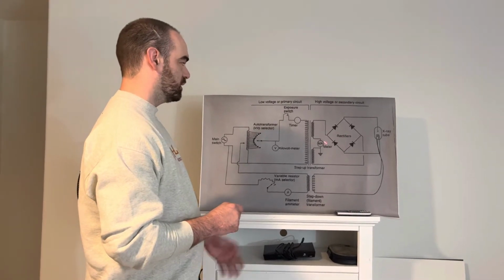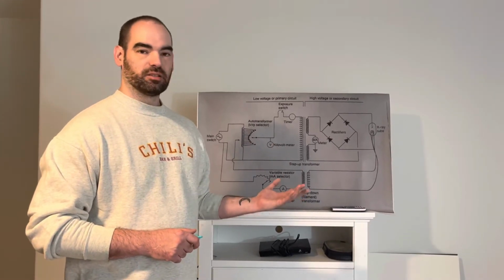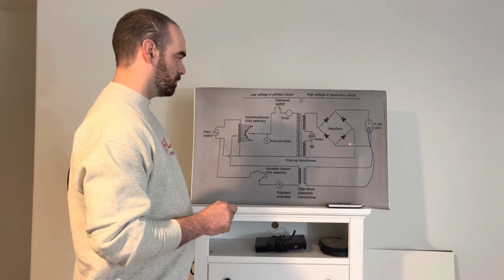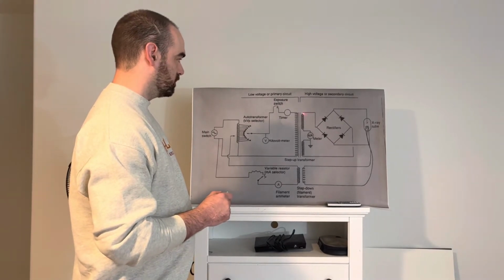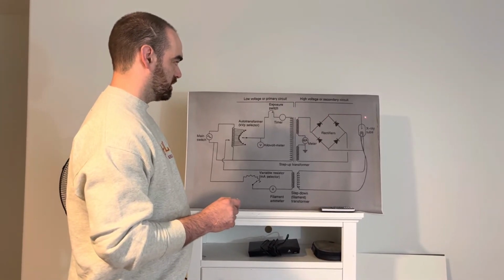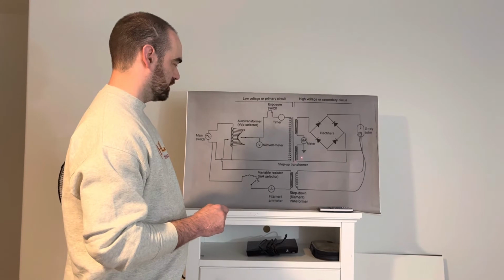Now the 4-diode rectifier is what changes the alternating current to a pulsating direct current. It will have 2 paths going back and forth through the rectifier. Path number 1 starts up here, goes here and up this way, and through the X-ray tube, over through the secondary diode here, down and ends right here.